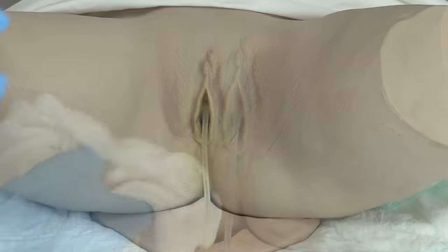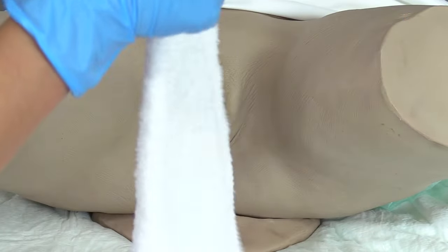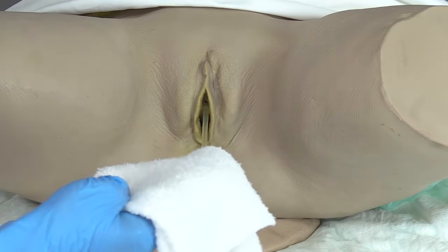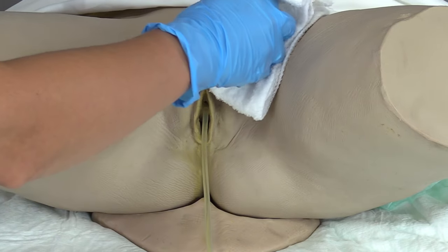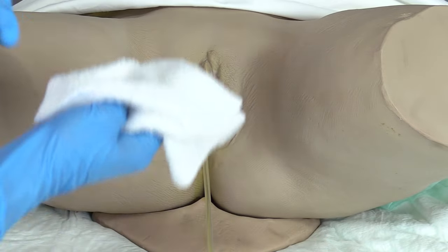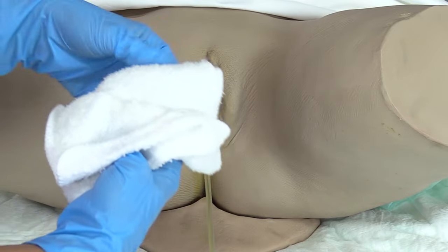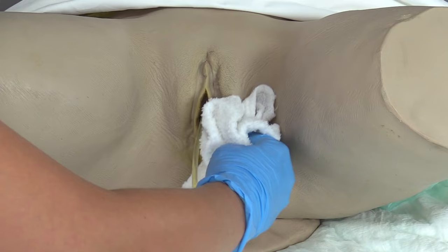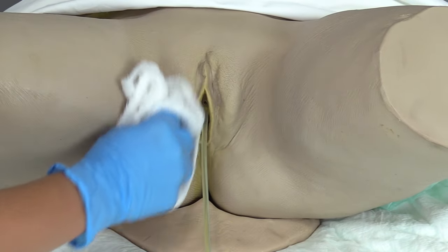Now we need to rinse. Now we have a new cloth with just water on it because we're going to rinse. So again, fold it in half, create your leaves. Warn the patient you're going to be touching them, and you're going to rinse again where you started. So rinse from top to bottom that inner thigh, pull back, rinse that other inner thigh, top to bottom, pull back, top to bottom, and then you have your last leaf, top to bottom.